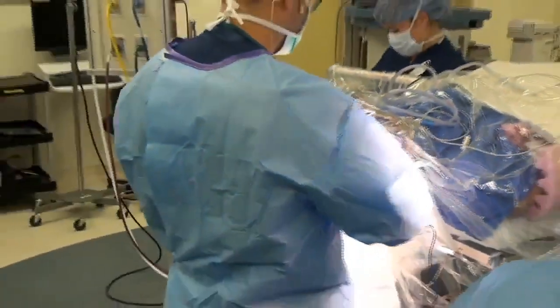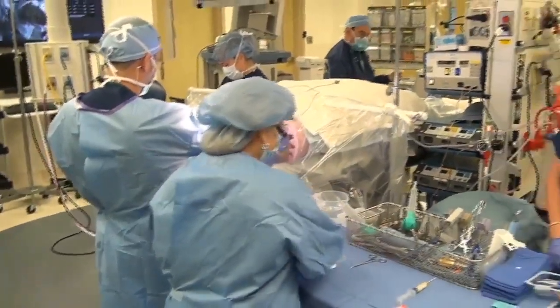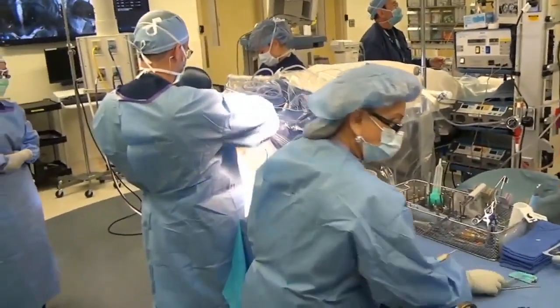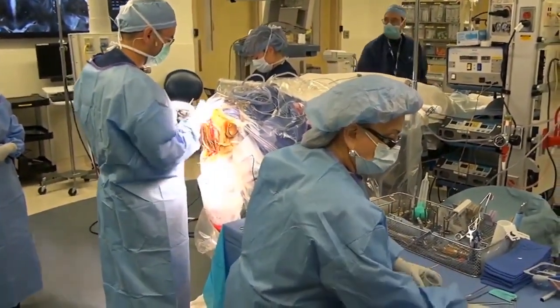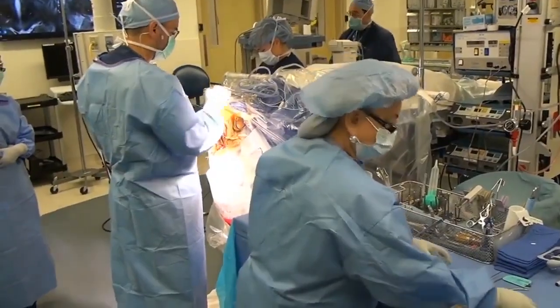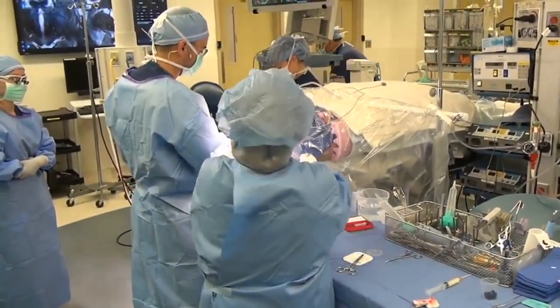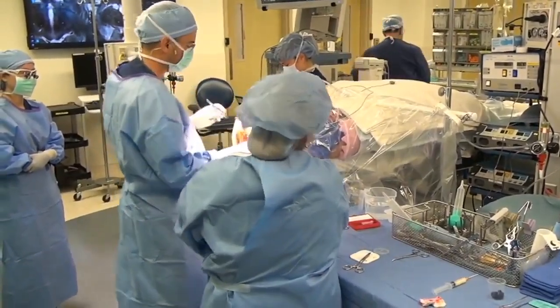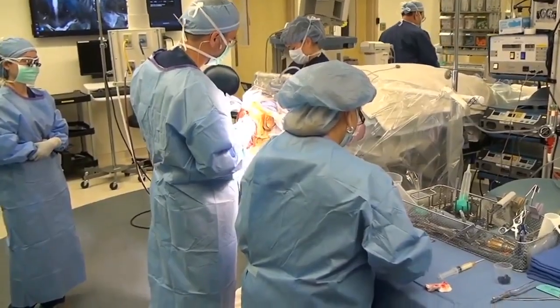Changes with the hardware. We now have 3 different devices on the market. That's competition. That just happened in the last year and a half, where we went from having 1 manufacturer of DBS systems to having 3 manufacturers of DBS systems. And with that comes new technology, and it's a technology that we get to test and evaluate to see how it influences efficacy of therapy and convenience of therapy.